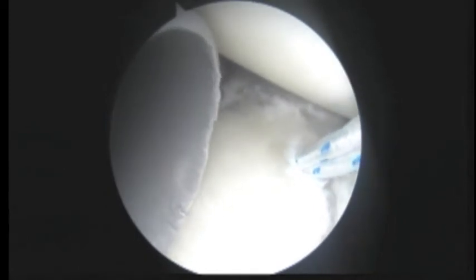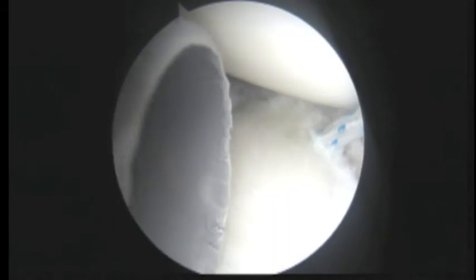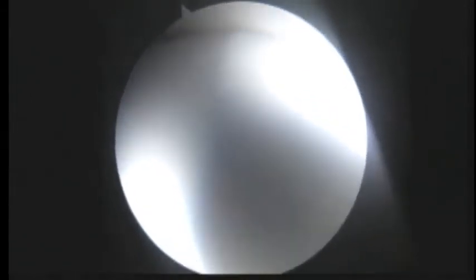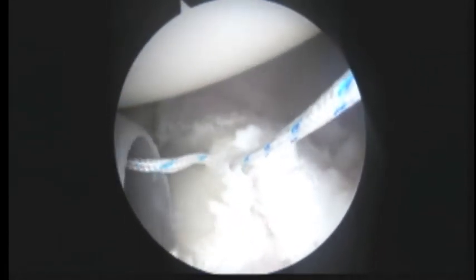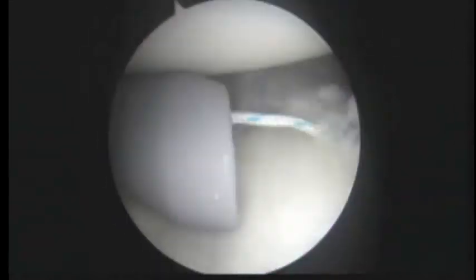So there's the first one. And then we'll go ahead and reach in from the back and take out one of the sutures here. Okay. And then we'll take our suture hook, turn to the left, rather. Show some more in just a minute. Pause, please.